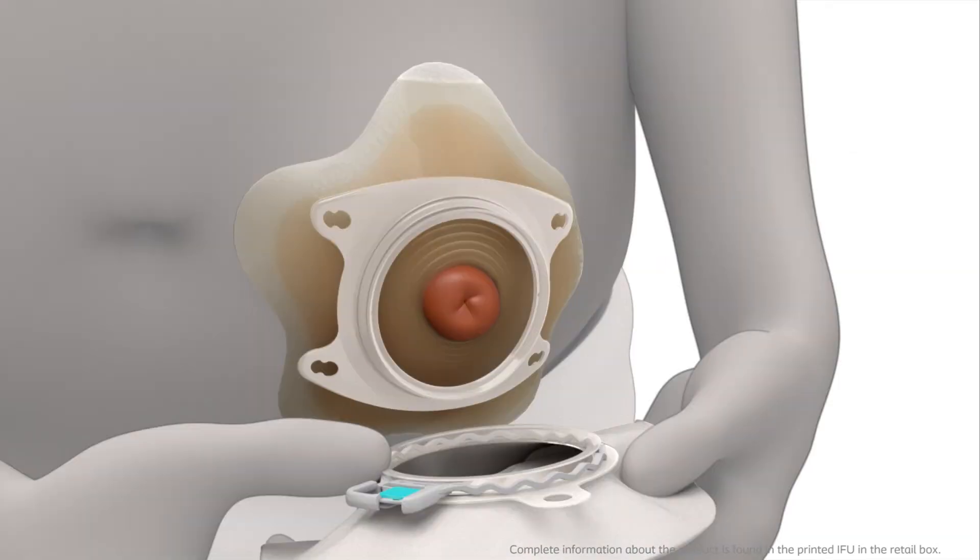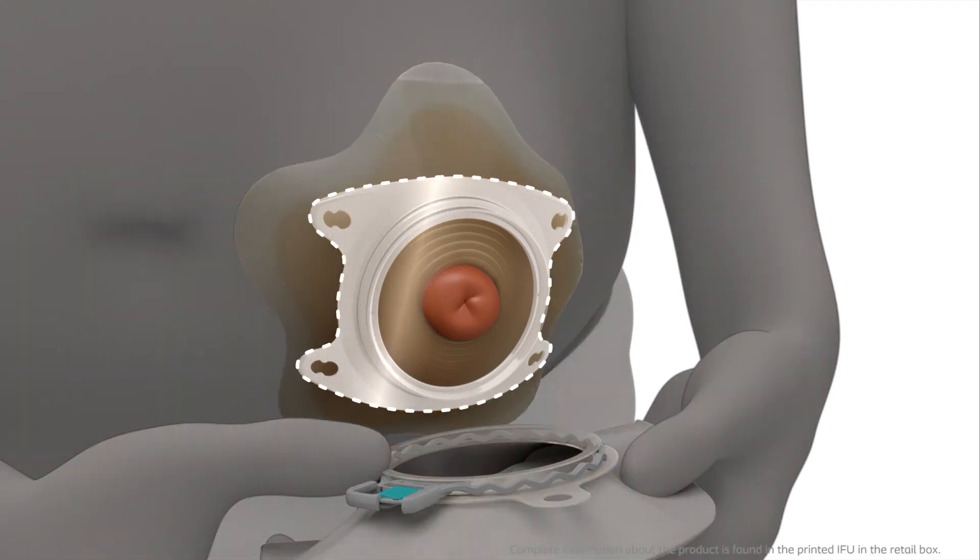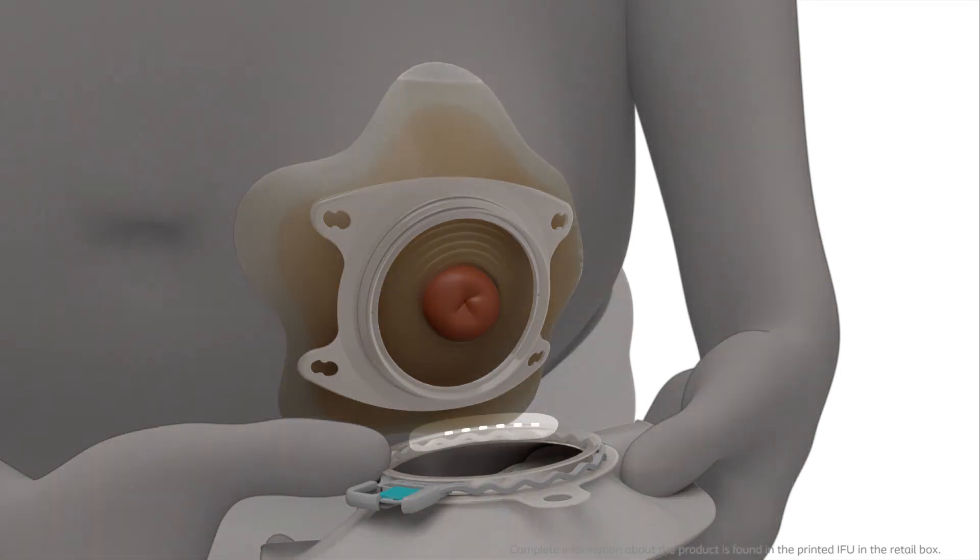Before applying the bag, make sure the base plate is clean. Check that the lock ring is open. Line up the bottom of the bag coupling with the bottom of the base plate coupling.